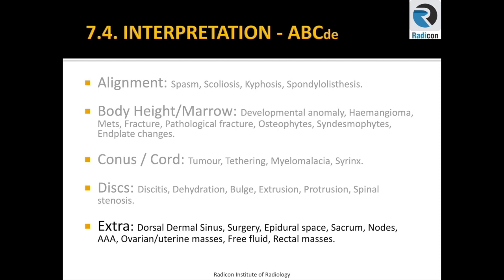That concludes our discussion on D or discs. We discussed alignment, A, body height, B, conus or cord, C, and discs, D. Next is extra features or E.